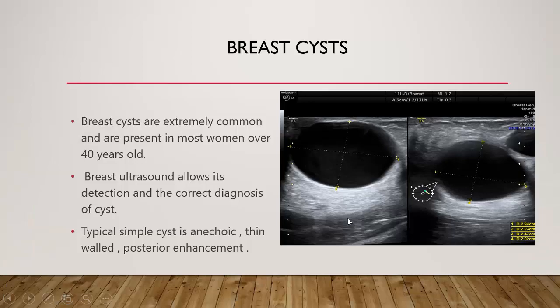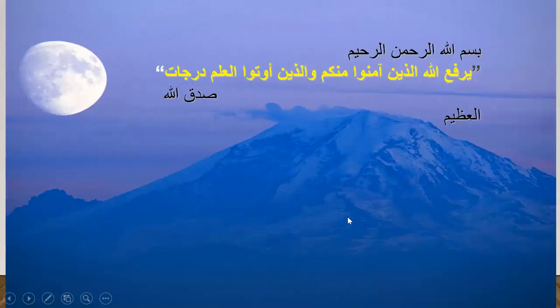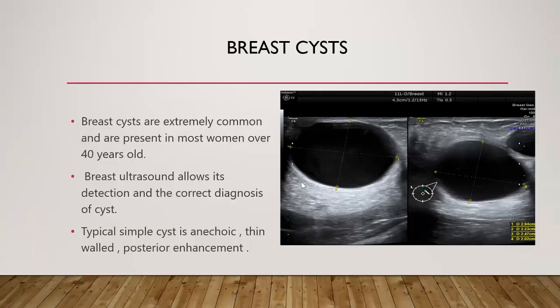This is our comments on the breast cysts. I have put on the group many cases. Some are simple cysts, some complicated cysts, and some complex cysts. So this is a short talk on the breast cysts and how to manage, how to recommend in your report, mainly ultrasound report, of course.